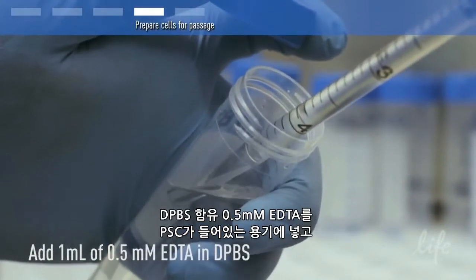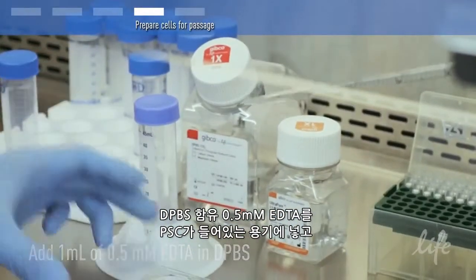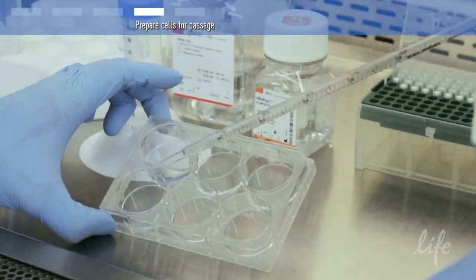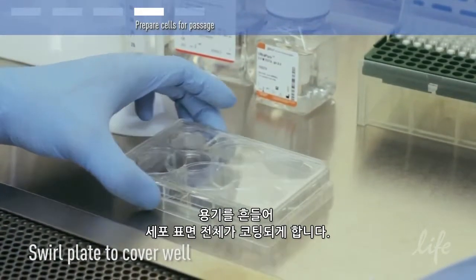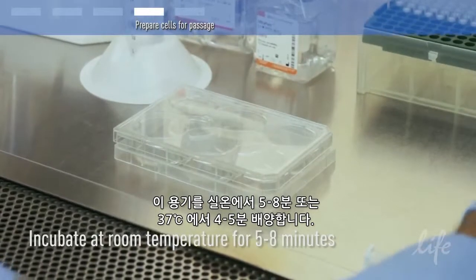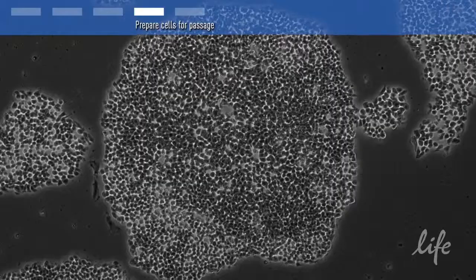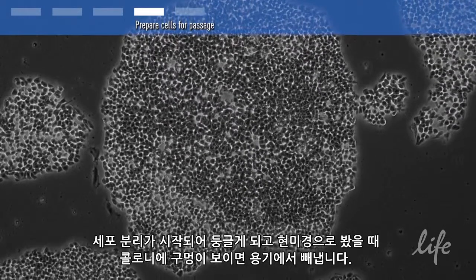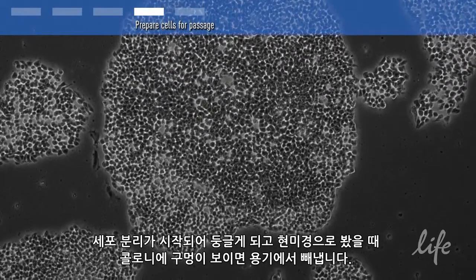Add 0.5 millimolar EDTA in DPBS to the vessel containing PSCs. Swirl the vessel to coat the entire cell surface. Incubate the vessel at room temperature for 5 to 8 minutes, or at 37 degrees Celsius for 4 to 5 minutes. When the cells start to separate and round up and the colonies appear to have holes in them when viewed under a microscope, they are ready to be removed from the vessel.